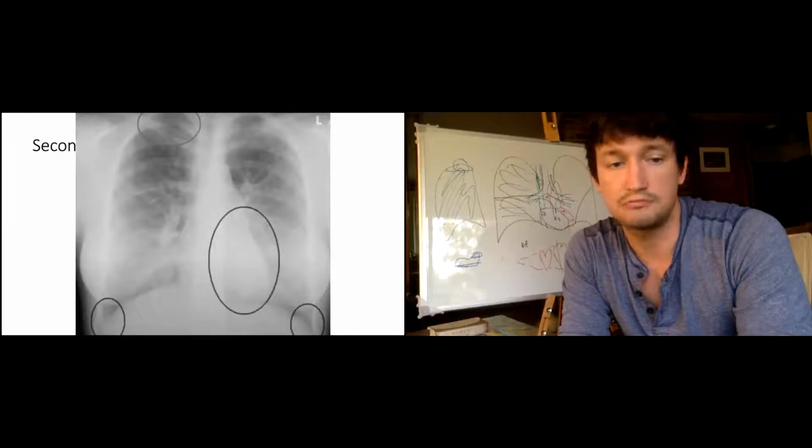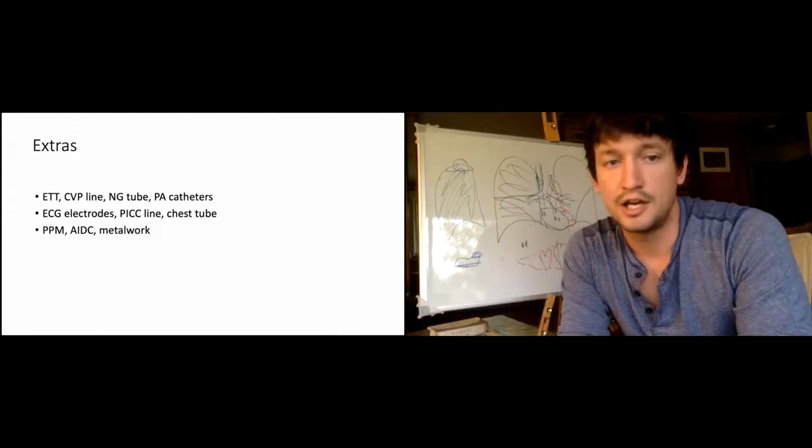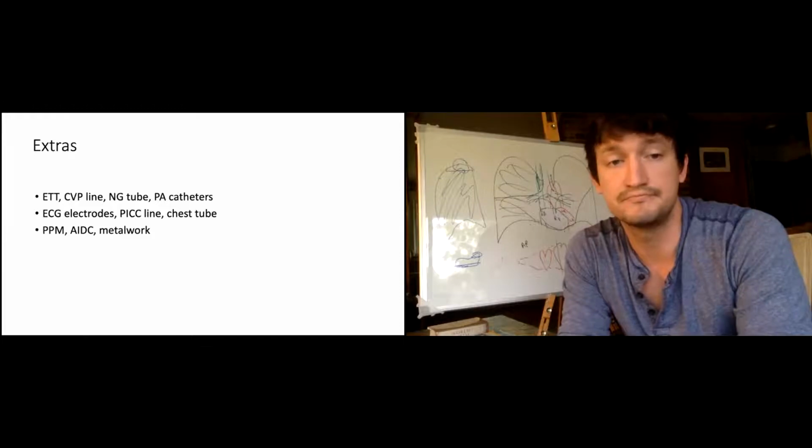This came up again. That's okay. Next slide. And then E is you look for extras. So all your tubes, all your lines, just anything else. Next slide.